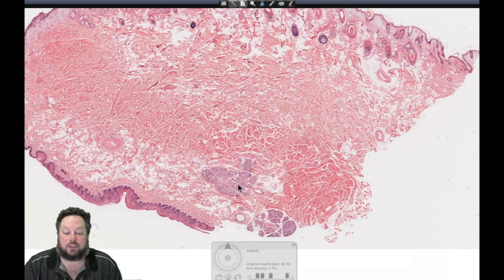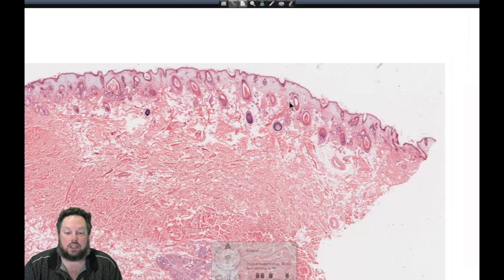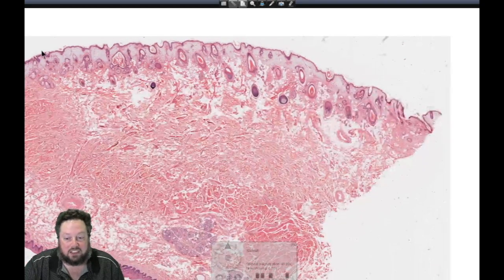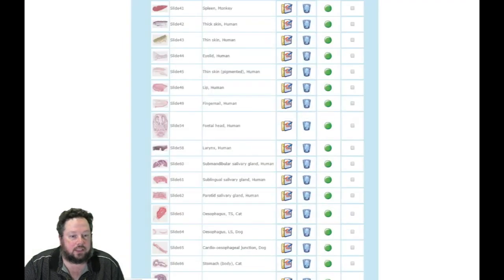Down here we've got the accessory salivary glands, so you can tell as well, if you can't completely identify that as non-skin or stratified squamous non-keratinized epithelium, the region with these accessory salivary glands is that oral surface, and then here we've got the hair follicles. Ariel, does that help answer your question? This is actually all skin except for the oral mucosa. So this is actually hairy skin, this is hairless skin, and then down here we've got oral mucosa. All right, great, thank you.